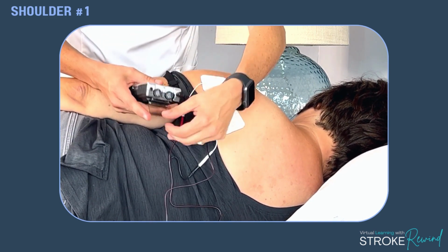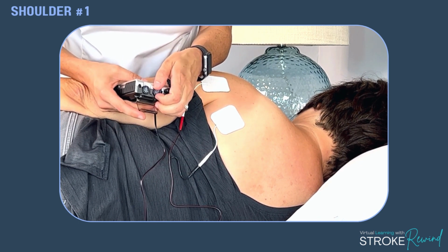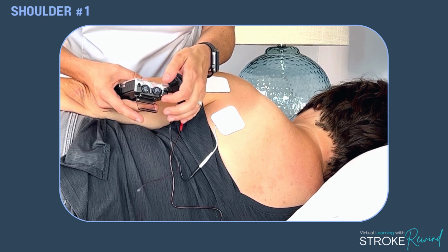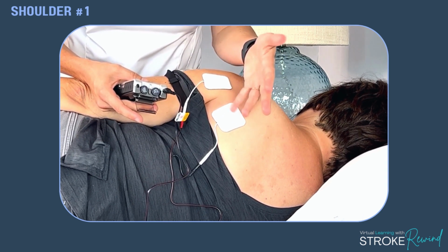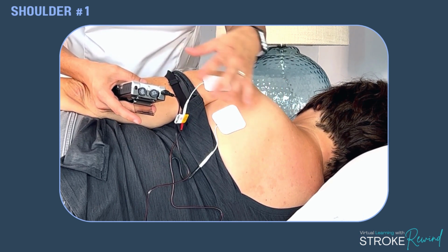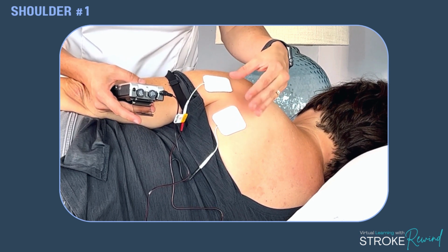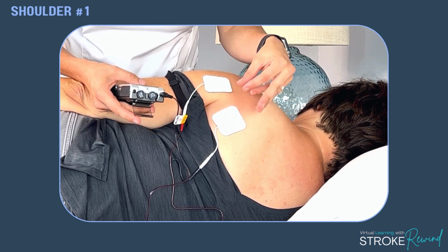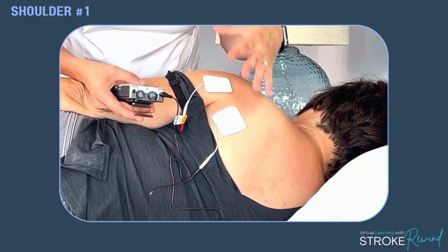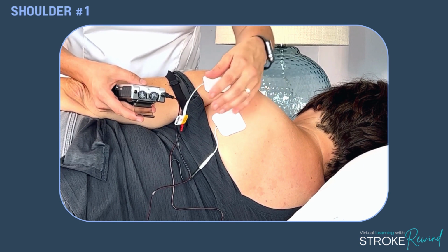I'm going to take the unit. I'm going to start by turning it on. And let me know when you feel it. The pattern here is you always ask the person, when do you feel it? And then once they feel it, you're going to start moving it up to see if you can get the electrical impulse to move the muscle. So remember, if you can move the muscle 1,000 times using this impulse, the brain is going to really start to fire and it's going to remember how it's supposed to be moving.